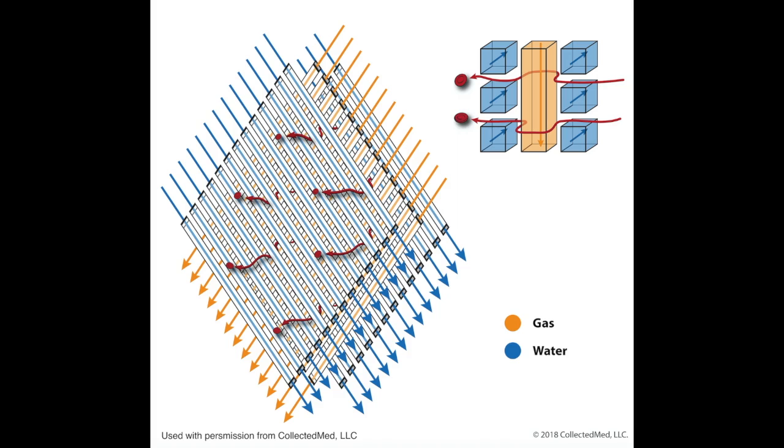This is an image of the microtubules inside the membrane lung with a close-up figure on the right. Each microtubule is bathed in blood, analogous to the capillaries surrounding alveoli in the native lung. When sweep gas runs through the microtubules, blood is able to extract oxygen and CO2 is removed. Blood also bathes microtubules or coils filled with temperature-controlled water that are usually embedded in the membrane lung. This means that ECMO tightly controls the patient's temperature.